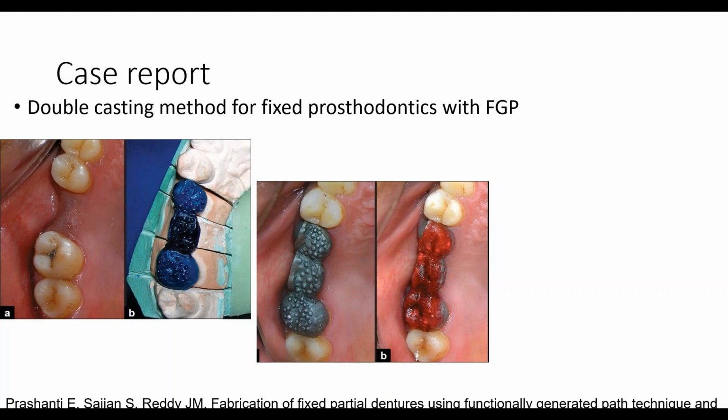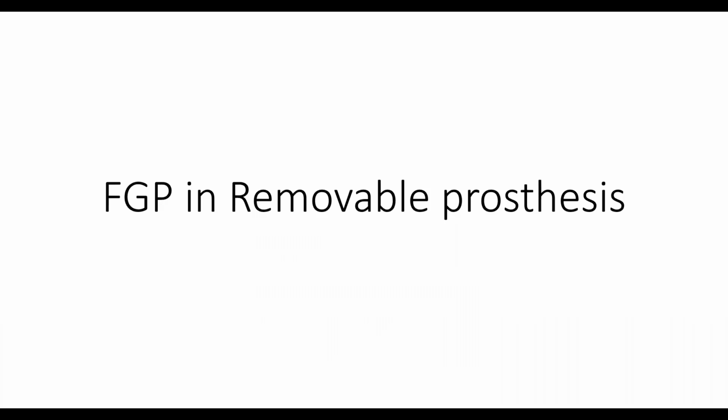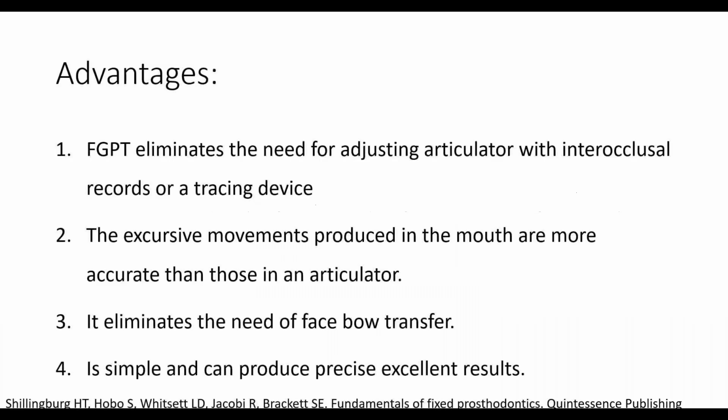After moving the mandible in the working and non-working side, a specific indentation will come on the pattern resin, and it can be cast. This helps in the proper recording of the opposing tooth and in building the functional cusp.